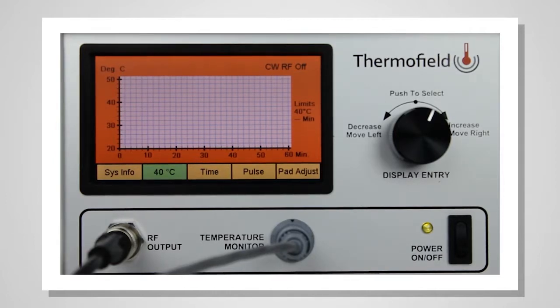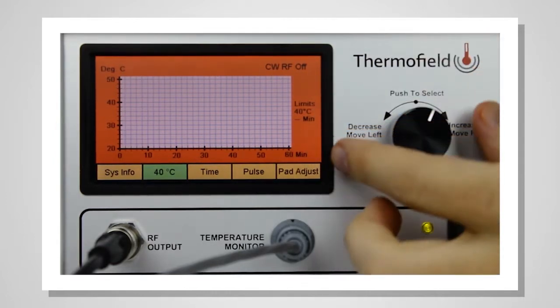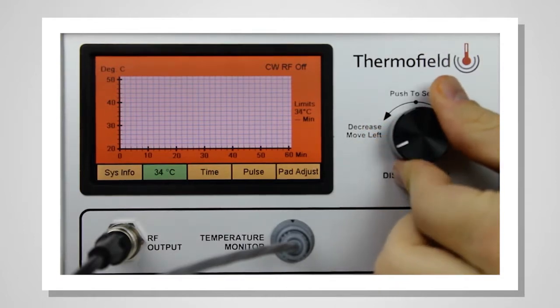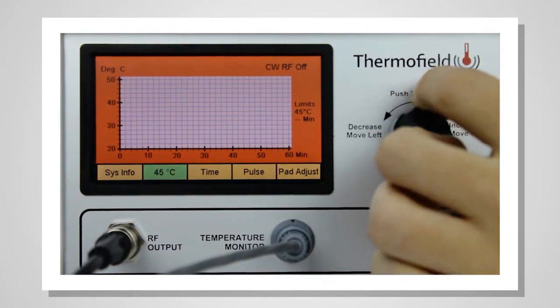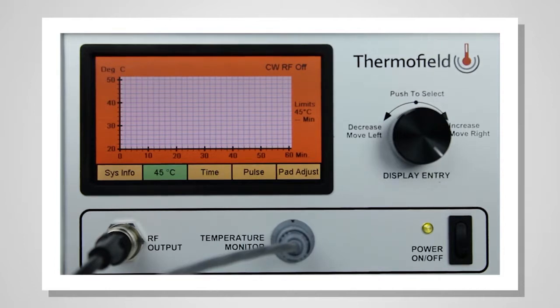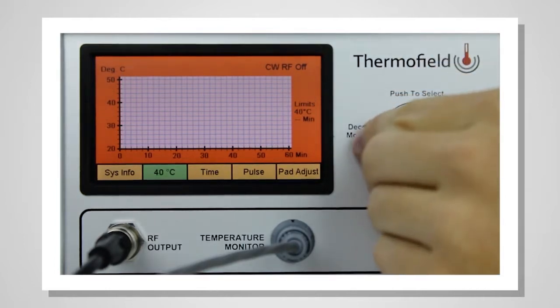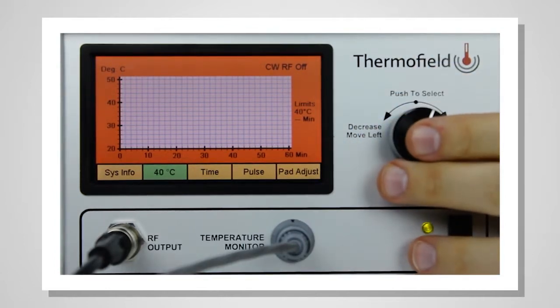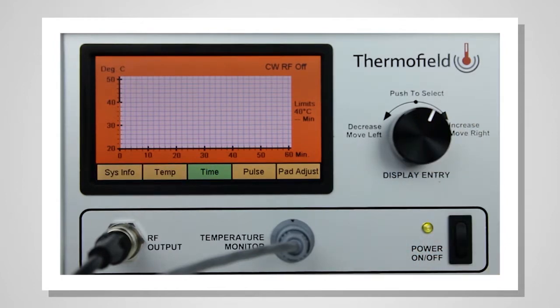To change the temperature value, push the selector knob again to select the temperature value and rotate the knob to select a new temperature. The value will be displayed on the right-hand edge of the screen in the limits field. When you've selected the right temperature, push the knob to confirm.